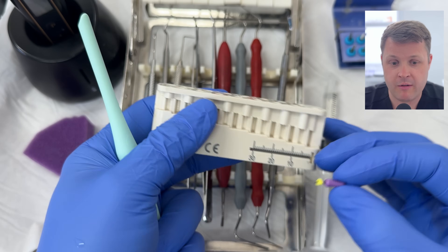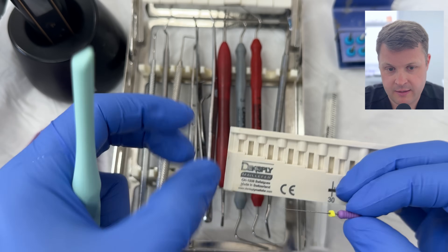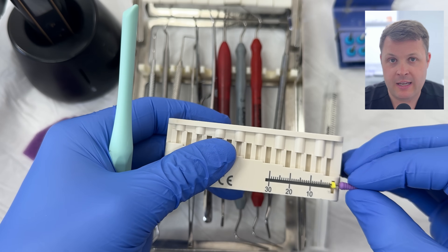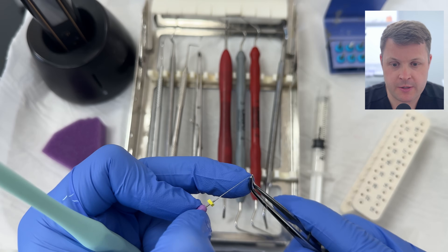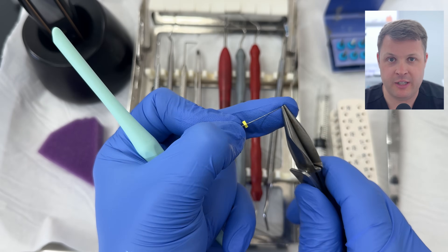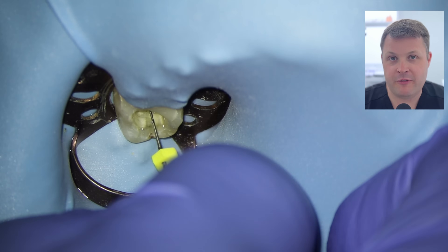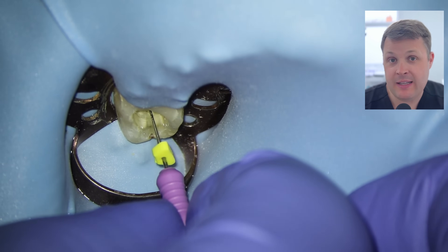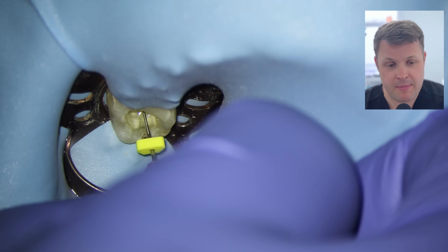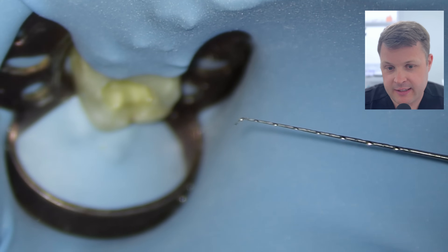Despite the bend, the file is still getting stuck. I'm measuring how far I've got — 21.5 millimeters on this distal canal — so I know I'm quite close to the end. I don't want to push this any further because if there's a ledge or an acute bend, forcing it will make it worse. I'm going to have another go with a size 10, because sometimes if you try a couple more times you can get past the bend. When negotiating, these files lose the tip bend, so you've got to keep re-bending and trying gently.